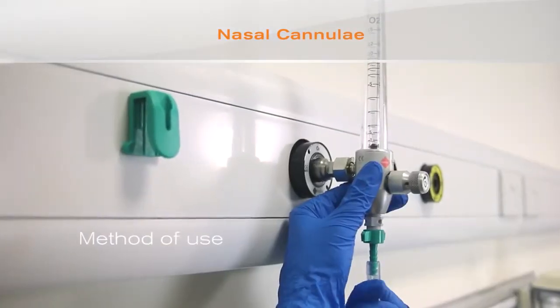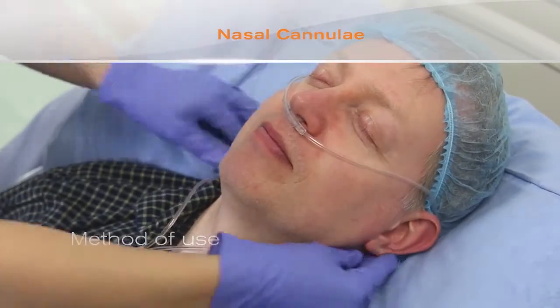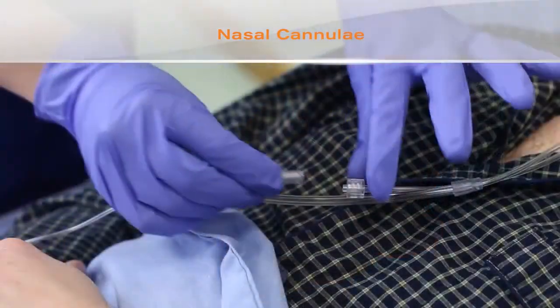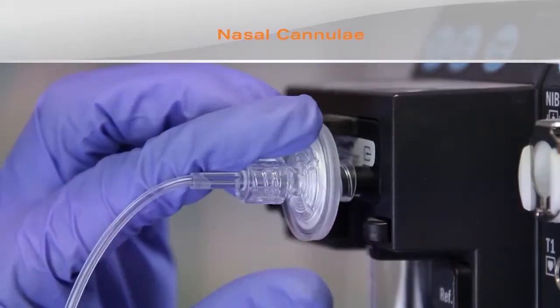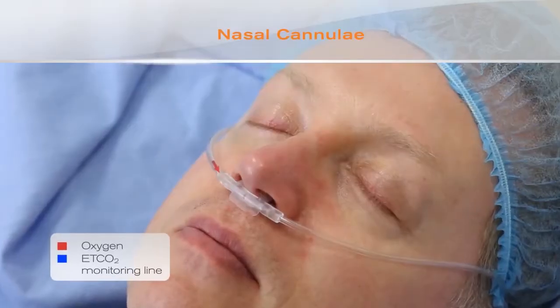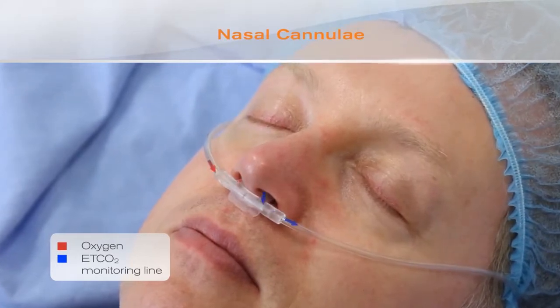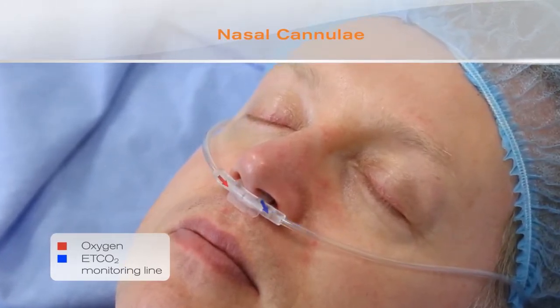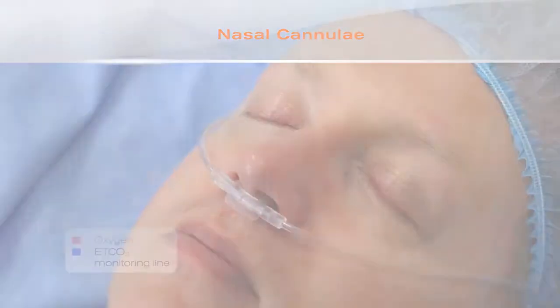The Sentry nasal cannula is fitted to the patient in the same manner as a conventional nasal cannula. A monitoring line is then attached and connected to the capnograph. The Sentry nasal cannula allows delivery of oxygen through one nasal prong and the sampling of exhaled gas through the other prong. The end-tidal CO2 values are comparable to those achieved with intubated patients.